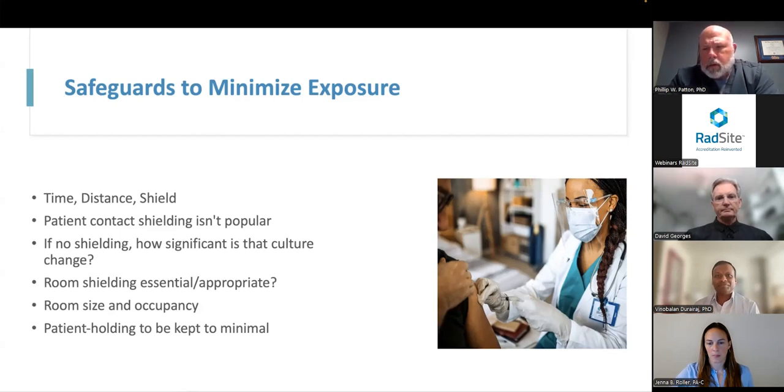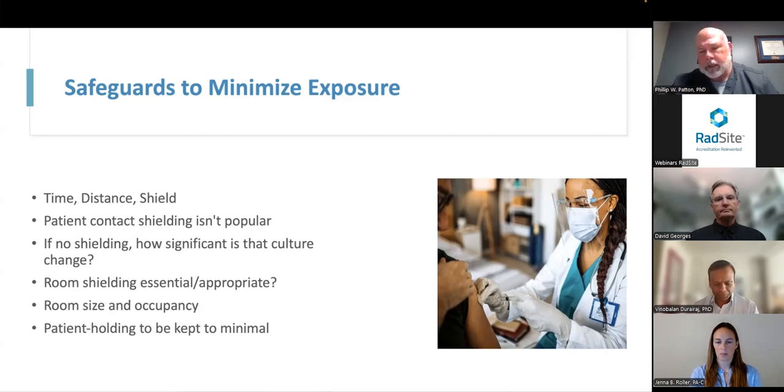So Dr. Patton? Yeah, so as you mentioned, the patient shielding topic has been reinvestigated. The AAPM and the ACR have come out with guidance saying that we shouldn't be shielding patients. And you want to look at, well, why is that so? Because we used to always shield them. There's a couple of dominant reasons. One is the equipment that we use has changed, so there's less leakage radiation and less off-axis radiation. In general, we're able to localize the beam in a better fashion without having radiation outside the beam.